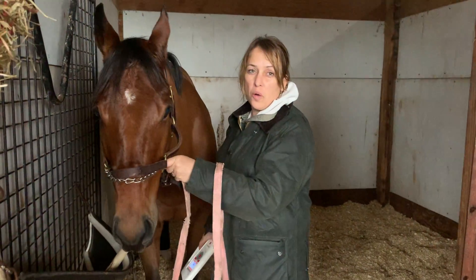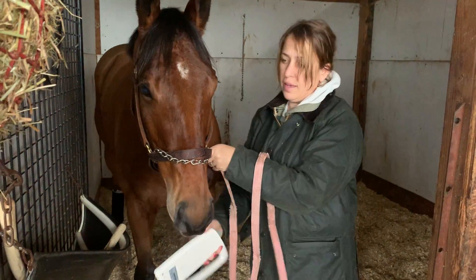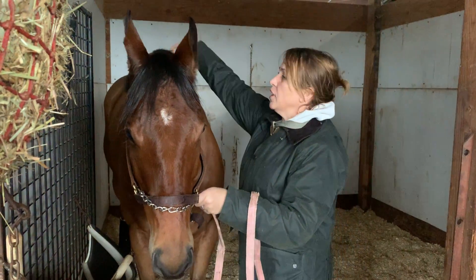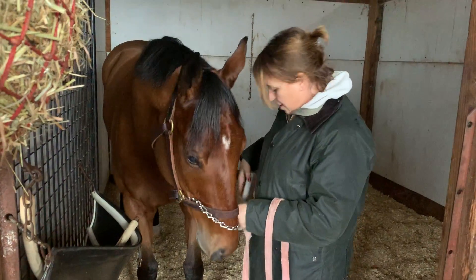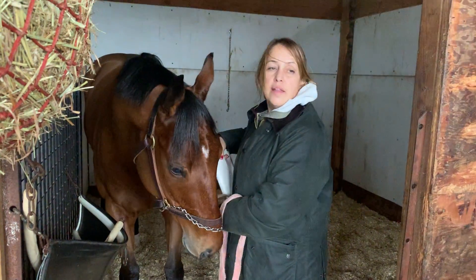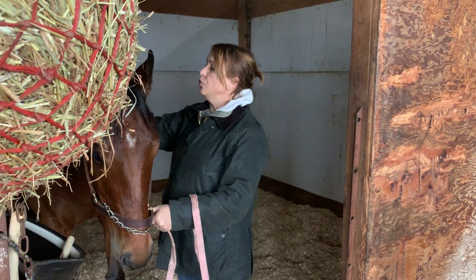We're here with the PTHA's Turning for Home doing our microchipping project. What we do is we scan the horses and make sure that they're not previously chipped. With this guy, there's no beep, so there's no chip. Dr. Tom is going to put a chip in the left nuchal ligament.